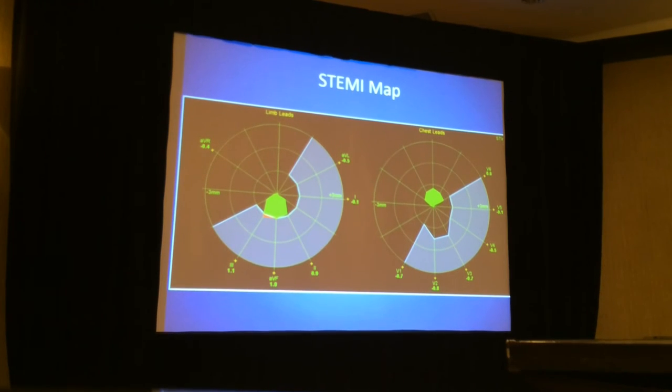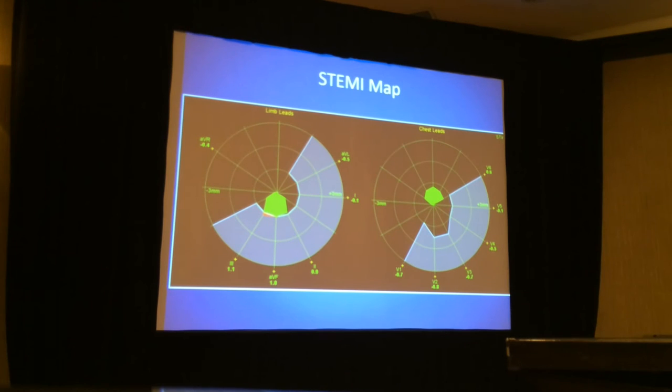John and his colleagues, and we did a collaboration with Olle and investigators in looking to develop this, came up with an image based on the ST segment, not only the waveforms, and certainly not only the measurements.